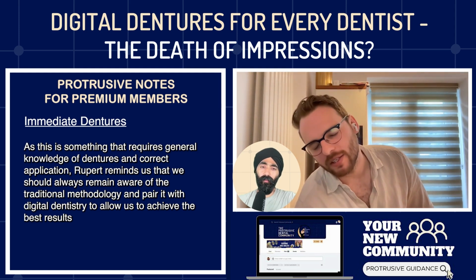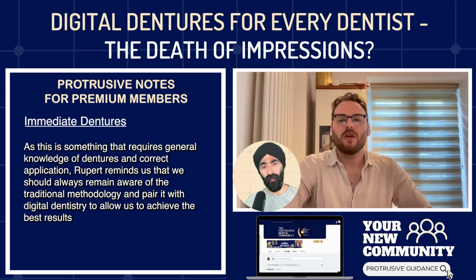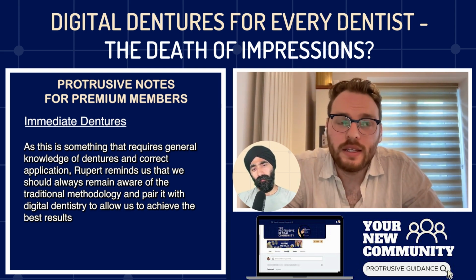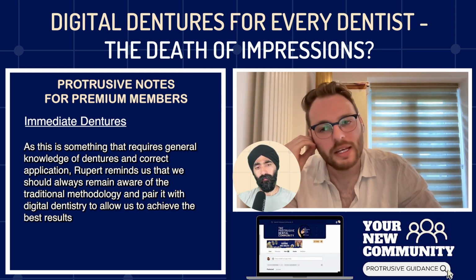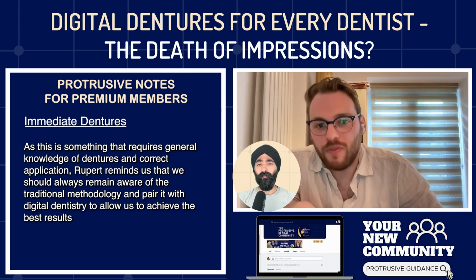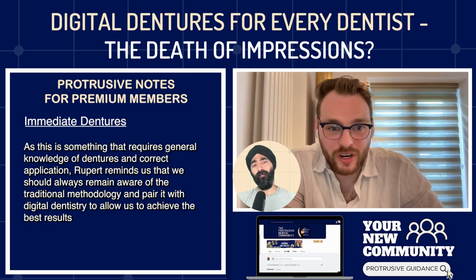Perio patients, amazing. Brilliant. And could you just use pressure spot indicator paste in those scenarios? You can. I find it a little more messy. You can get specific silicones as well, specific fit checker silicones that set faster than your standard light body. So you could use PIP. I find PIP is more useful at review when there's an ulcer and you dry it, put it on the ulcer and see where it transfers.